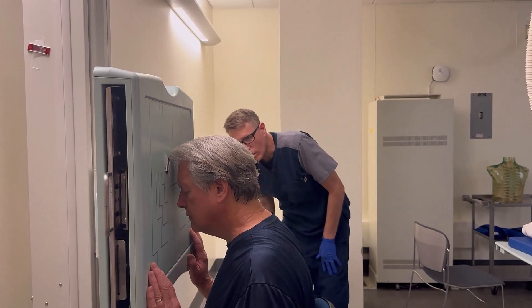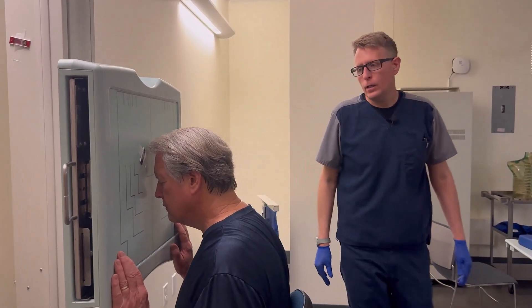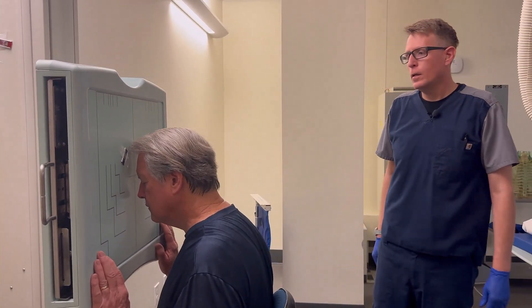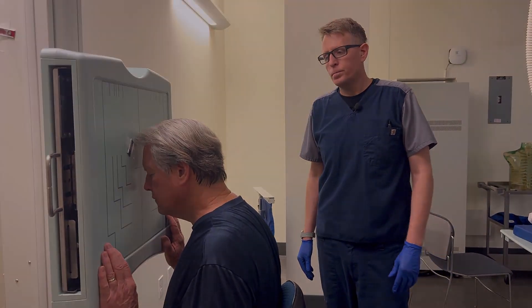PA Caldwell, central ray exiting the nasion, done on suspended respiration.